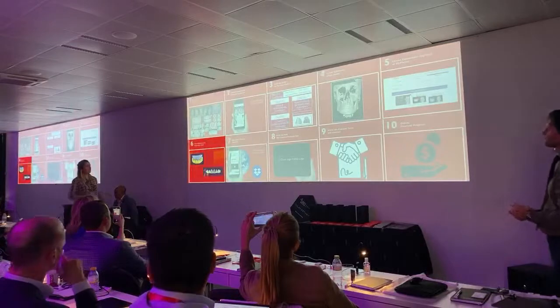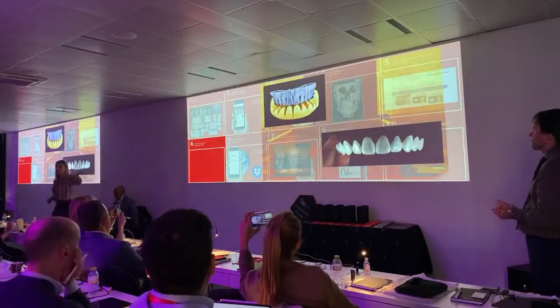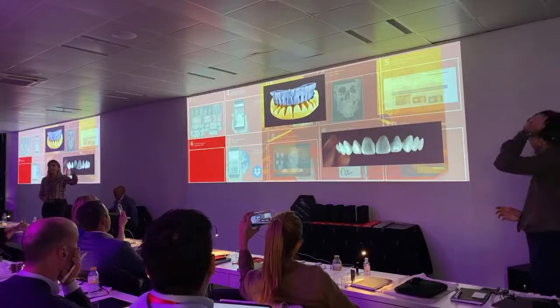And then the DSD coordinator will make sure that your model with the silicone index is ready or your shell is printed for the second appointment.